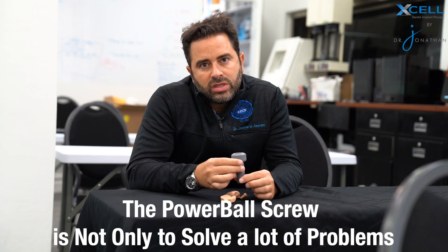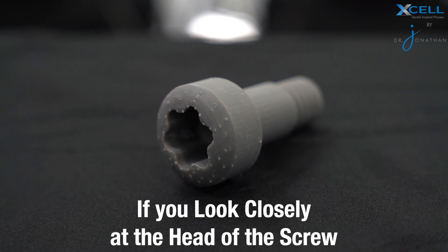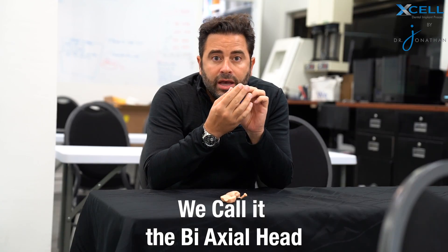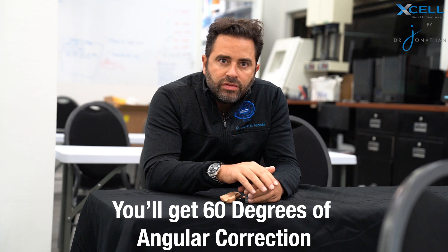My Powerball screw was invented to solve a lot of problems. Number one, if you look closely at the head of the screw, the head of the screw is what we call a proprietary biaxial head. This allows you to change the angle up to 30 degrees — no more facial access holes, no more thimble restorations, no more veneers to try and close the access hole. So if you use a 30-degree multi-unit abutment and you use my Powerball screw, you have 60 degrees of angulation correction. Now that's tremendous.